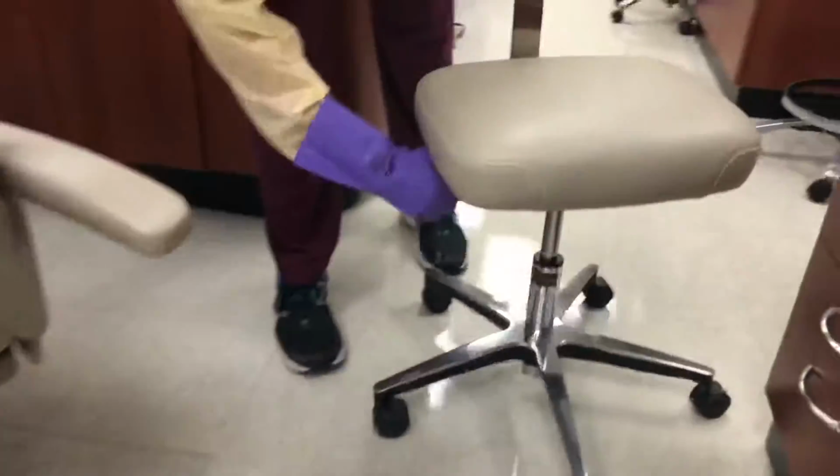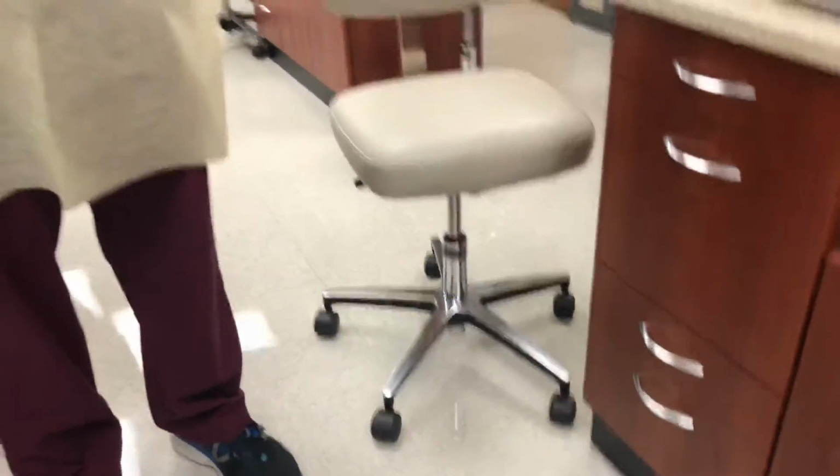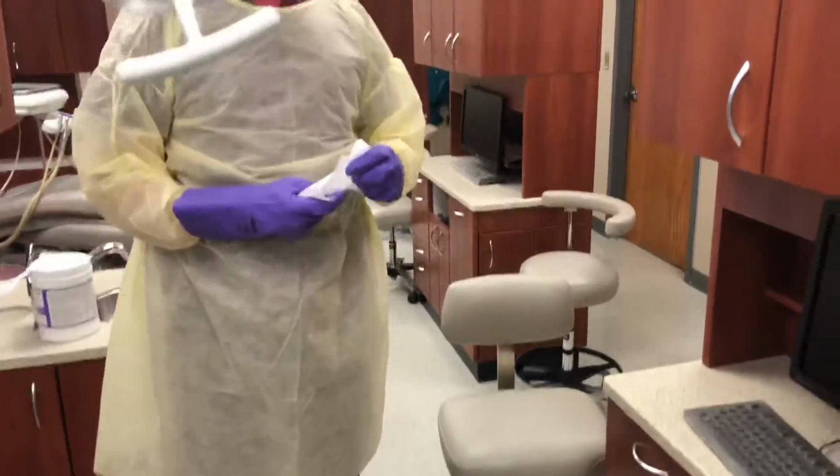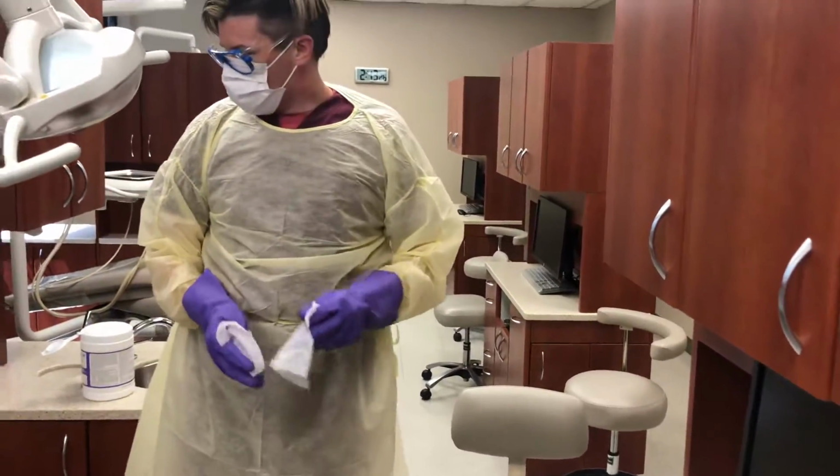Some chairs may not have the black knob. It may just be a metal stick or rod. Just wipe what is there. The outside of your personal storage container, all sides and underneath. Cord box at the foot of the patient chair.